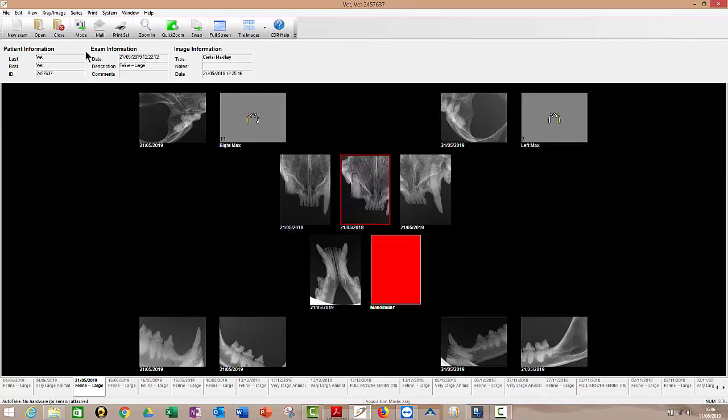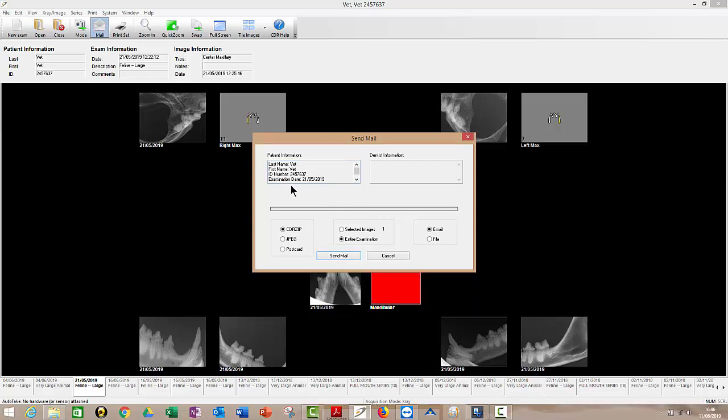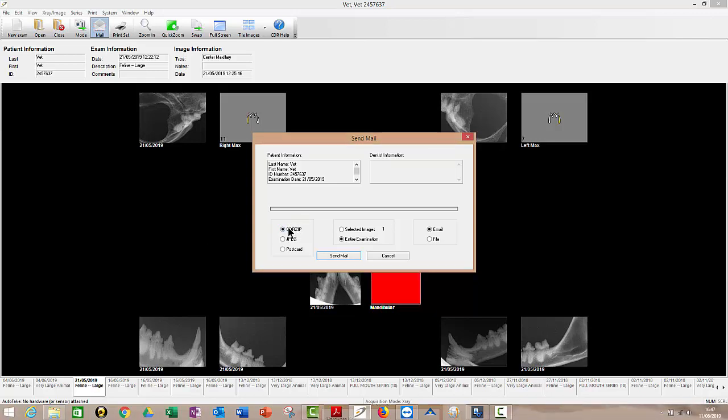The other way of doing it is if I click on Mail here. If you've got Outlook installed on your laptop or PC, you can send an email. It would have the name of the patient here, date of birth and examination date. And you can either send it as a CDR zip, which is the original DICOM images. So if you were sending it between two different practices, for example, both of which had the CDR software, you could send it. And as it arrives in the inbox at the other practice, once they click open, it will open within their own Schick software as if they'd taken the images themselves with no loss of image quality. So that's good if you happen to have that ability.